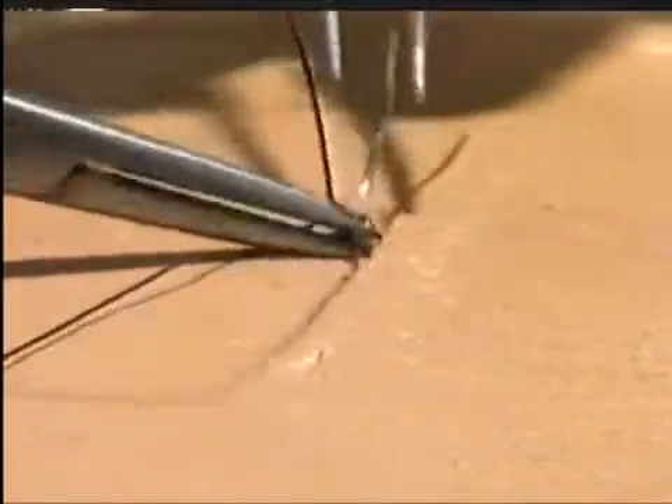You can see here a needle going in just at the skin edge, taking a bite of the subcuticular tissues and coming out at the skin edge.